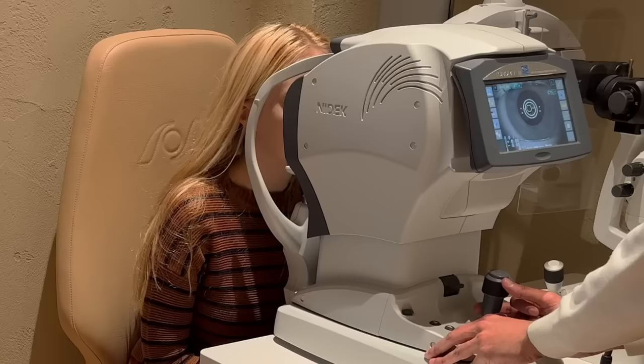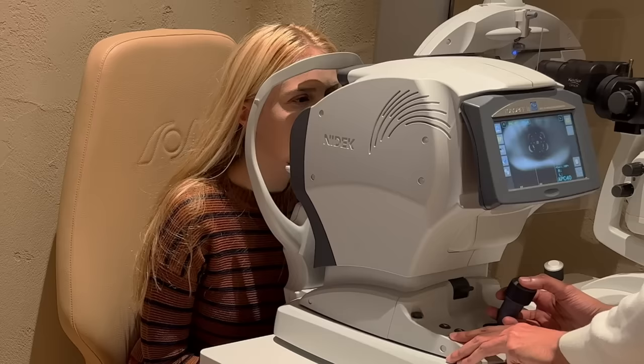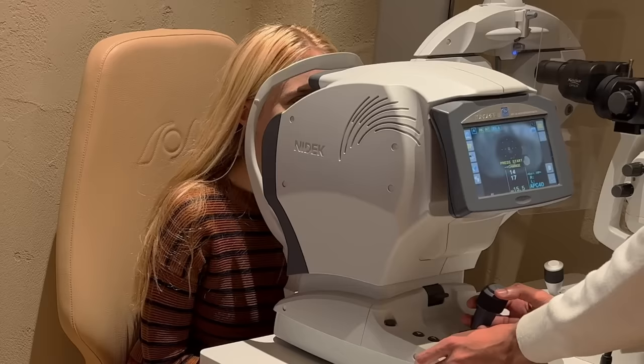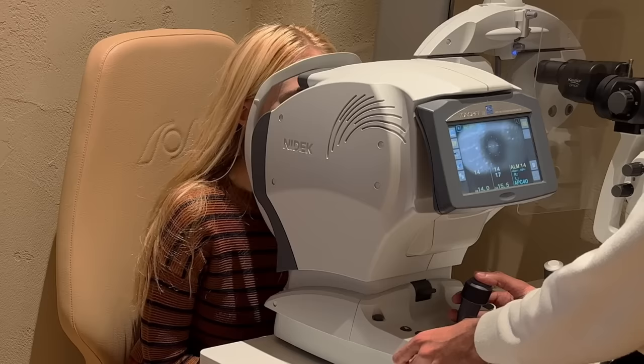Perfect. So I think we'll check the pressures of your eyes now. It's a puff of air in each eye. Have you had that before? Possibly. It's the one that makes me jump. Maybe. Let's see. Look at the green light. That's it. Do one more. Okay, it's the last one. Perfect. Go to the other eye. Okay, last one. Awesome, it's really good. You can sit back. Thank you. It wasn't too bad, right?